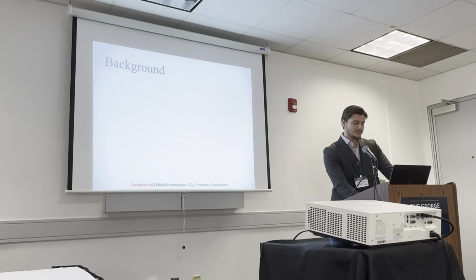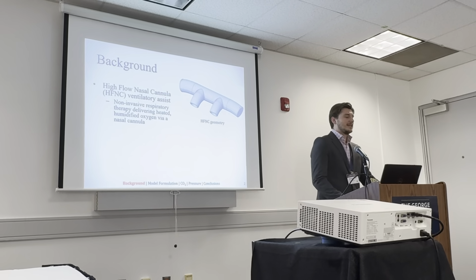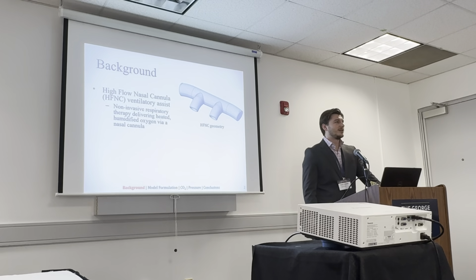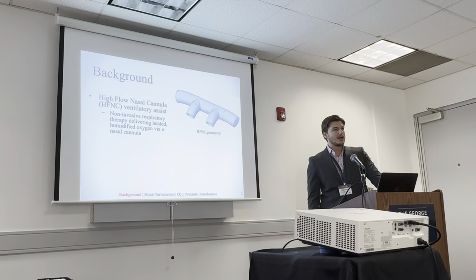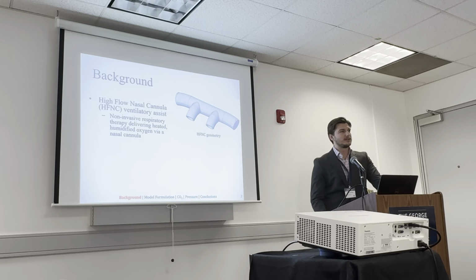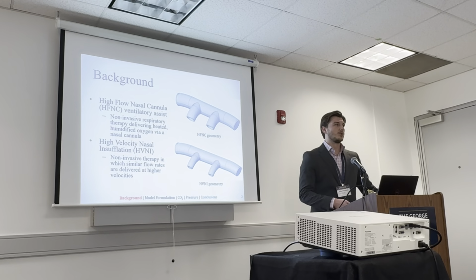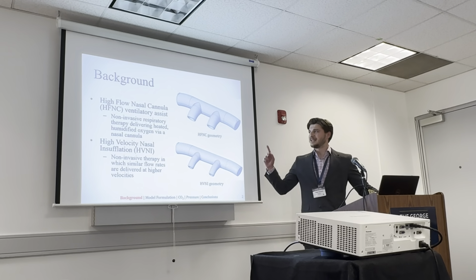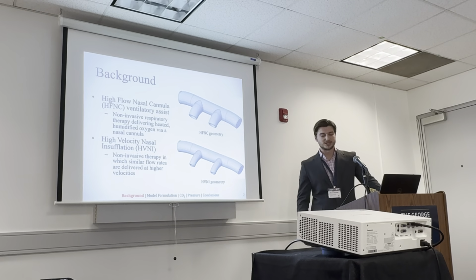Some quick background before we get into the CFD, because this study was done with CFD as well. High flow nasal cannula, or HFNC, ventilatory assist, is a non-invasive respiratory therapy in which heated and humidified flow is delivered to patients at higher flow rates than previously seen in conventional oxygen therapy. High velocity nasal insufflation, or HVNI, and we're going to be using these acronyms throughout the presentation today.